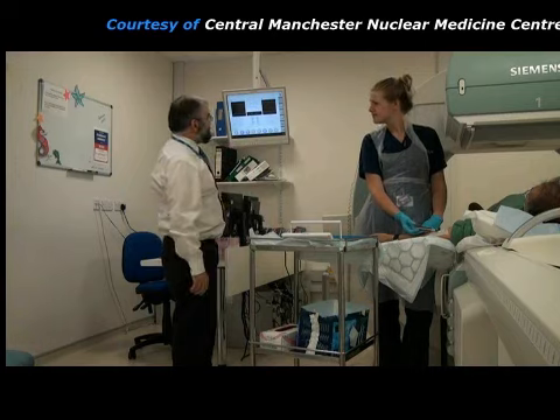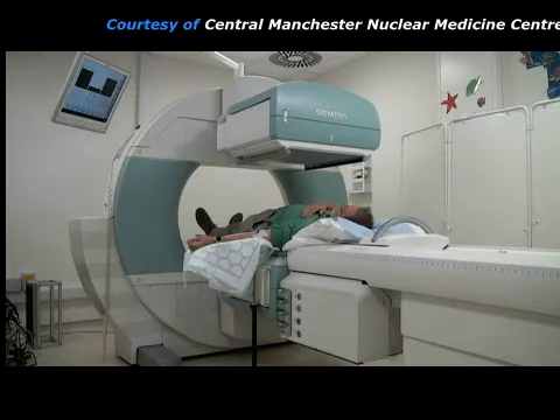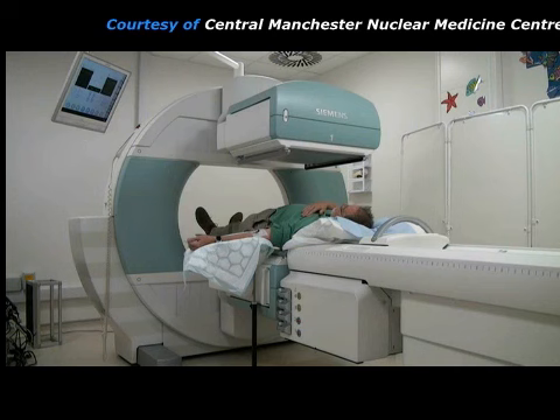As soon as the radiopharmaceutical is injected, the gamma camera starts acquiring a sequence of pictures which will show how well each kidney is working and how quickly the radiopharmaceutical is moving through the kidneys and into the bladder.